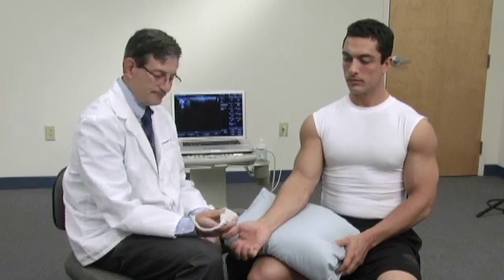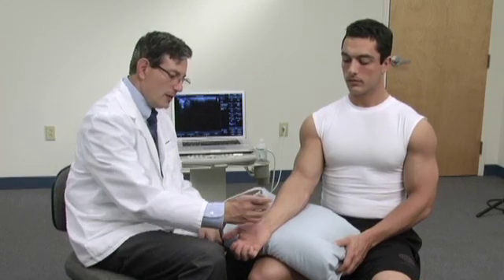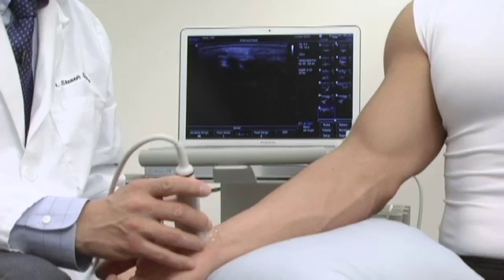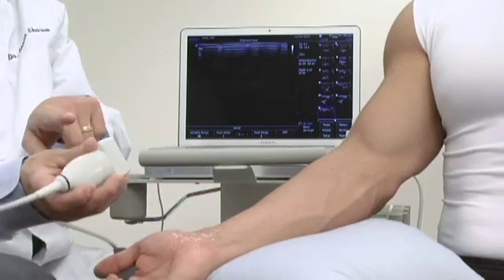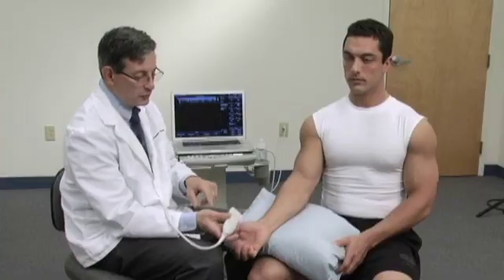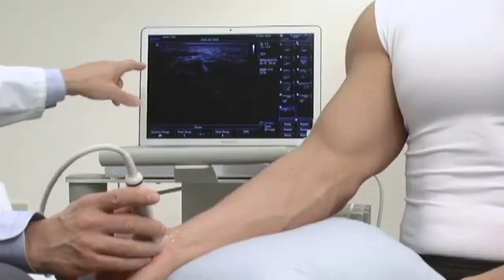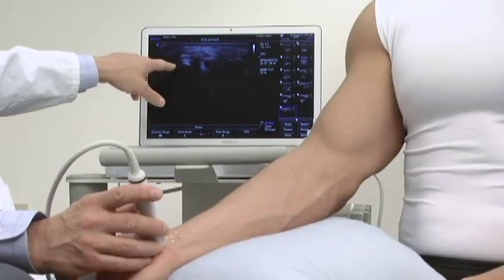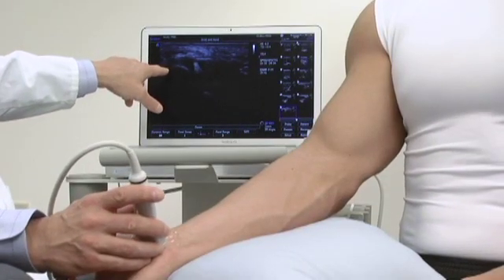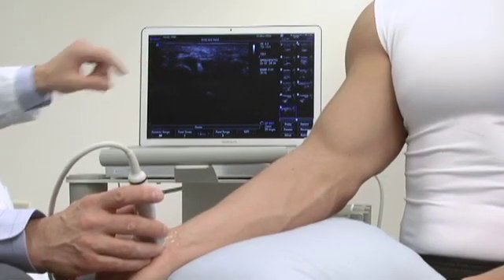We're going to do a transverse view of the palmar aspect of the wrist so that we can evaluate the median nerve. We'll place the probe with the notch facing towards the patient's right-hand side, and consequently that will appear on the left side of the screen.